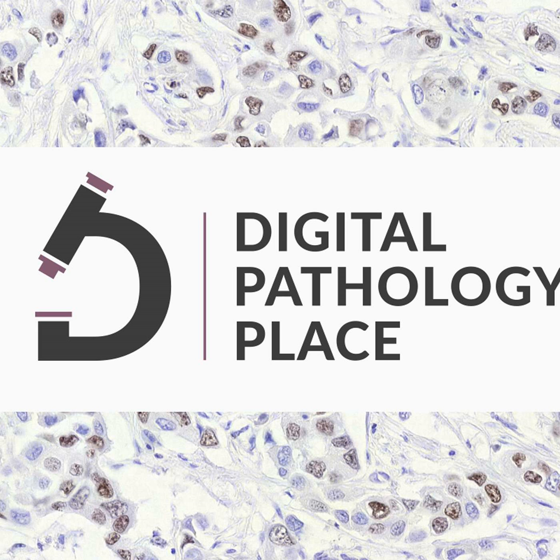Yes, and this was crucial. They built a feedback mechanism directly into the IMS. While reviewing, pathologists could quickly flag image patches the AI analyzed as either correct or incorrect. Closing the loop. Exactly. That feedback wasn't just noted, it was used to retrain the model. This cycle of deploying, getting user feedback, using QC tools, and retraining was key to getting the tool across the line for user acceptance and performance.